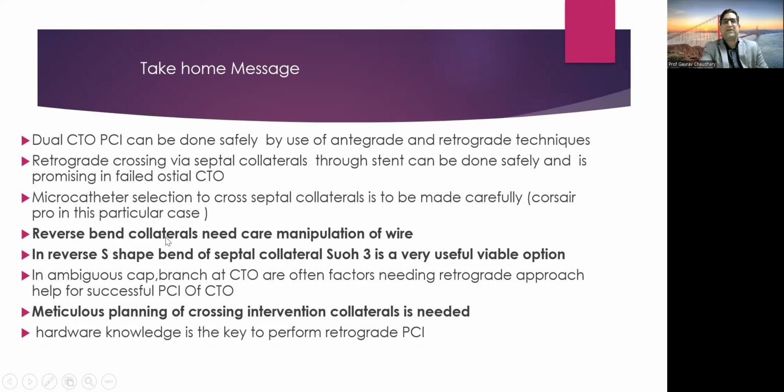And this kissing wire technique or marker wire technique is one of the first techniques that a retrograde operator should adopt, because this is a bit easier as compared to the reverse CART or the knuckle CART that we will discuss later. So thank you all for patient listening, and I would be coming in the next session, that is session 4, with the discussion about the crossing from the retrograde wire coming from distal lumen to the proximal lumen, that is wire to wire, distal retrograde wire lumen to lumen approach. Thank you.